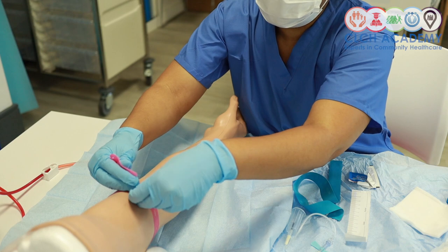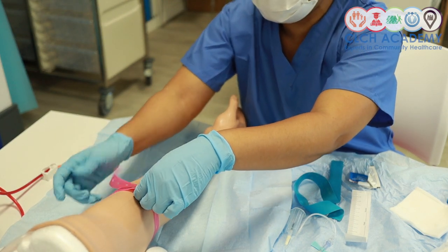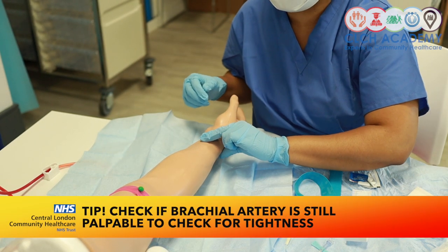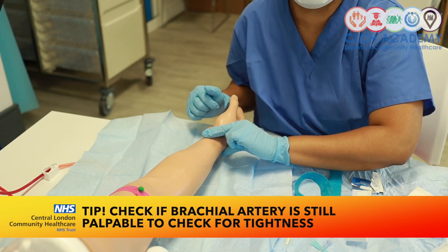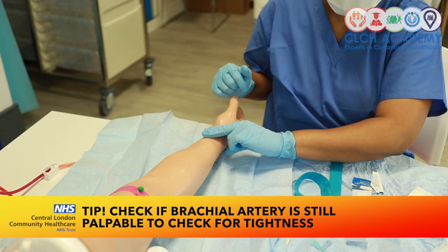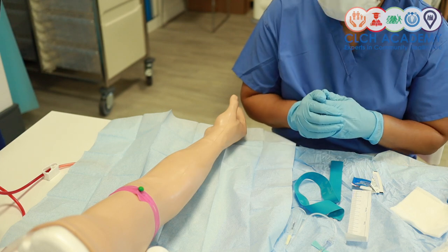Some people would suggest that you should be able to fit in two fingers. However, I believe two fingers could be subjective. Some people have small fingers, other people have larger fingers. A better way to check whether that tourniquet is on too tight is to feel for the brachial artery once that has been put on. And I know my patient is still alive, so that is good. I've got a nice strong pulse there. Right, I've put on my tourniquet.